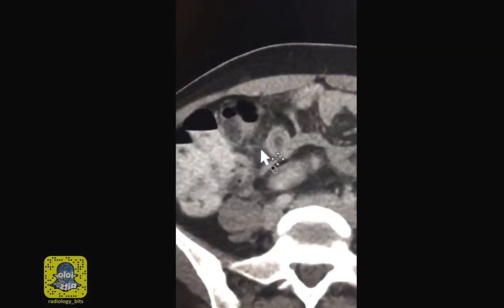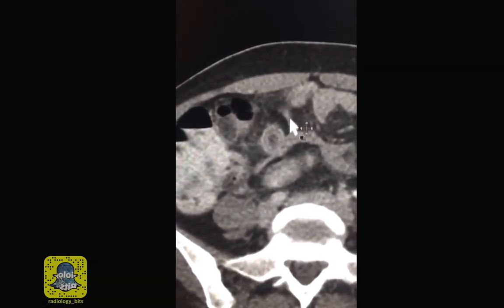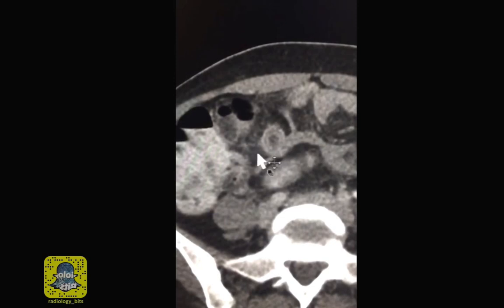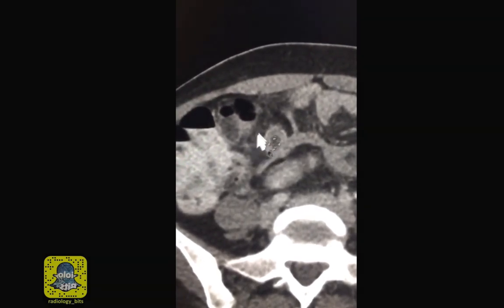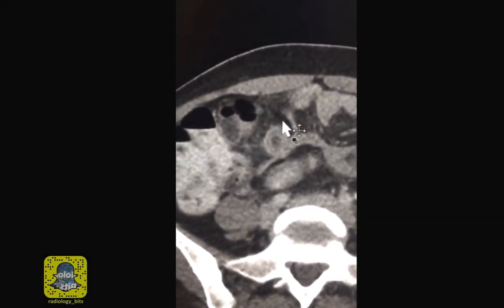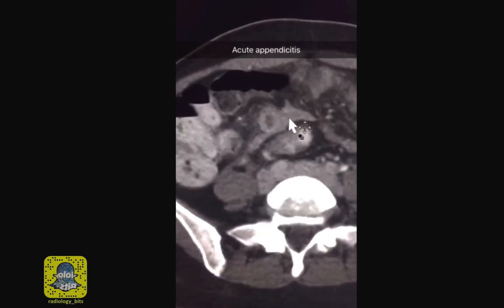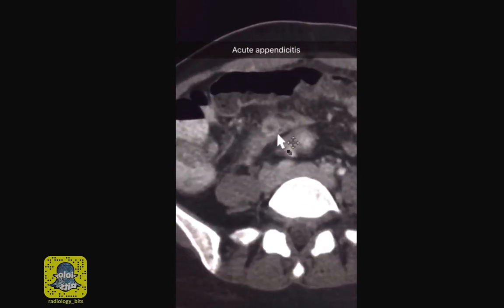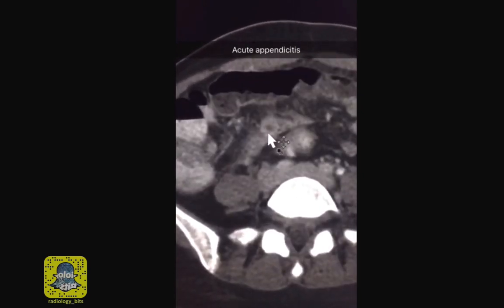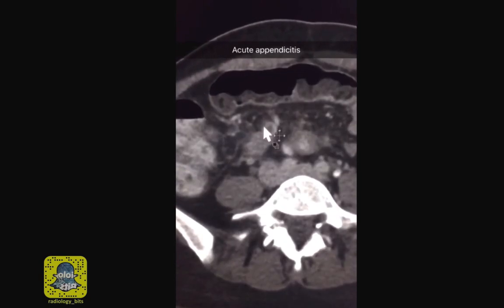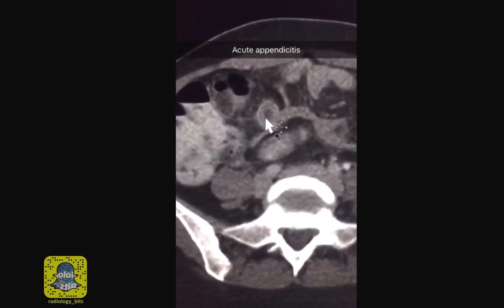It's now more clear that the fat around the appendix is not as clean as expected — compare that to the subcutaneous fat. This is fat stranding, a sign of inflammation. So in this patient with right lower quadrant abdominal pain you have a dilated appendix with mural edema, surrounding fat stranding, and fluid — consistent with appendicitis.